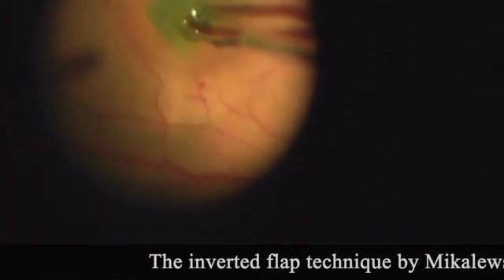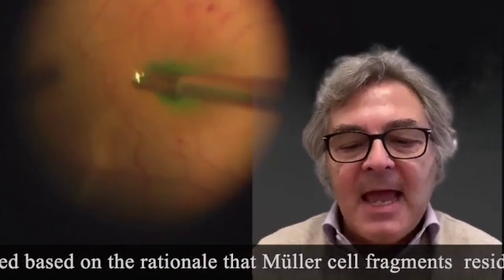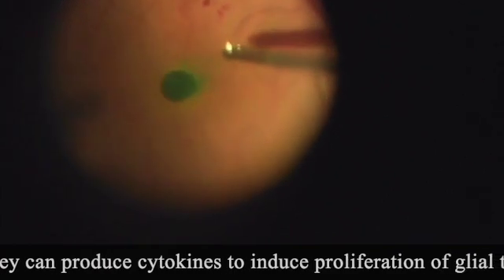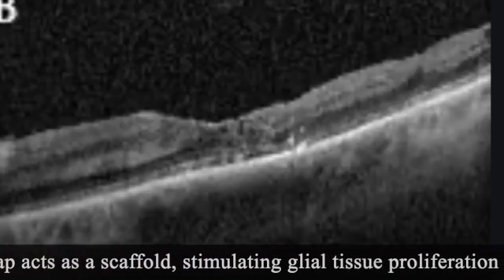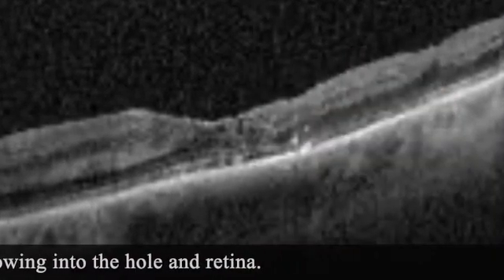The inverted flap technique, developed by Michalewska in 2010, is based on the rationale that Muller cell fragments reside in the ILM, and they can produce cytokines to induce proliferation of glial tissue. The inverted flap acts as a scaffold, stimulating glial tissue proliferation on the surface and growing into the hole and retina.